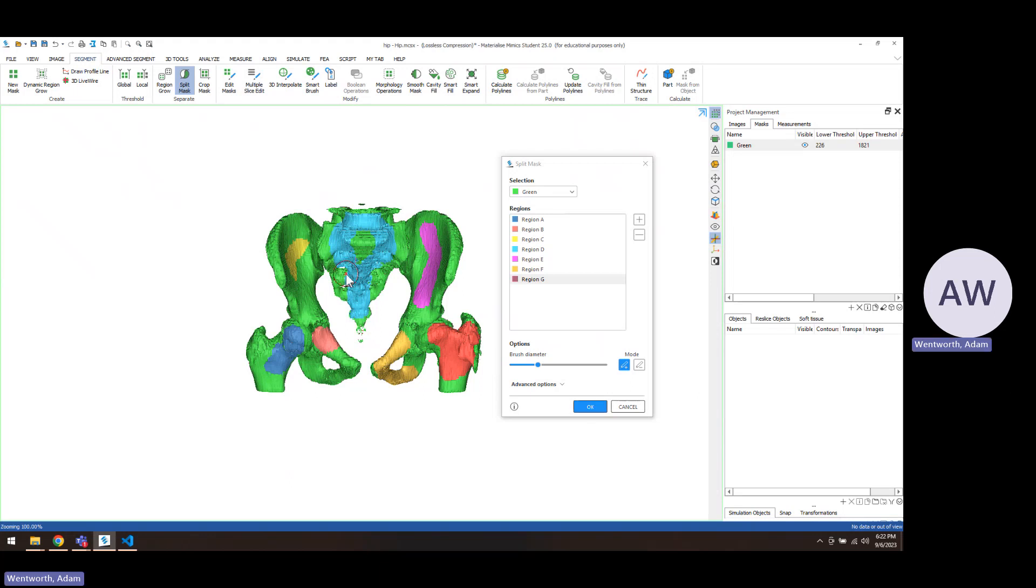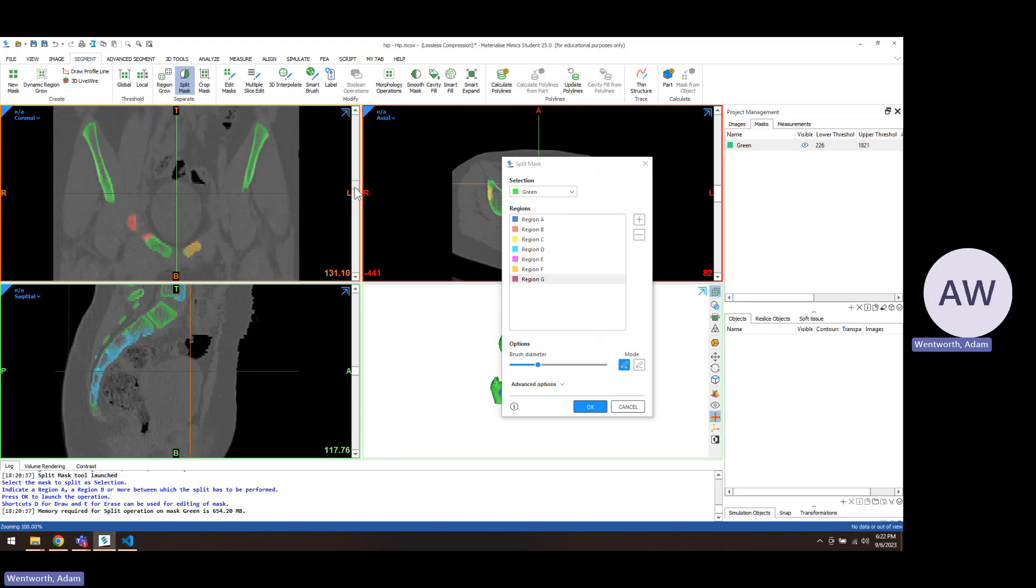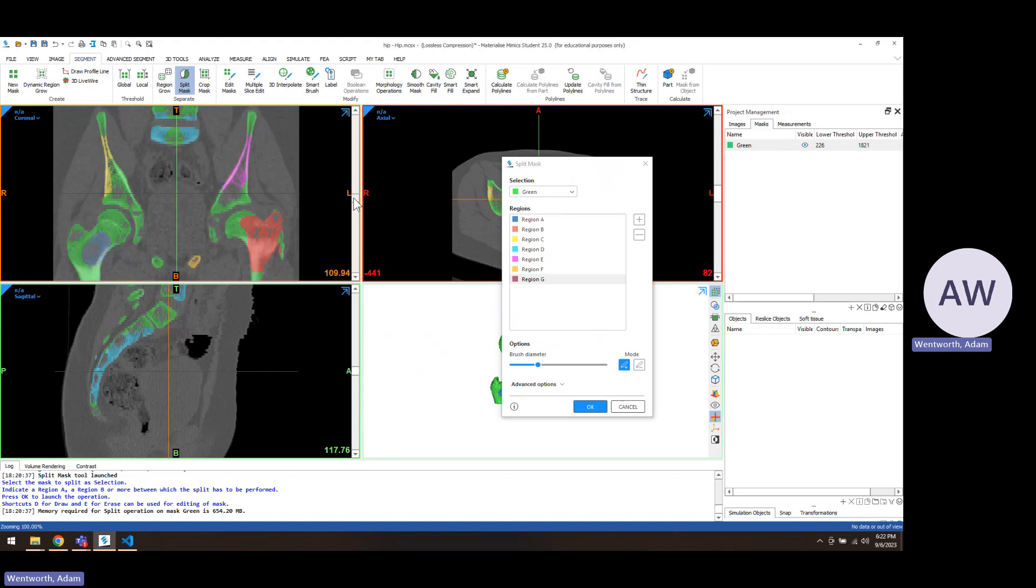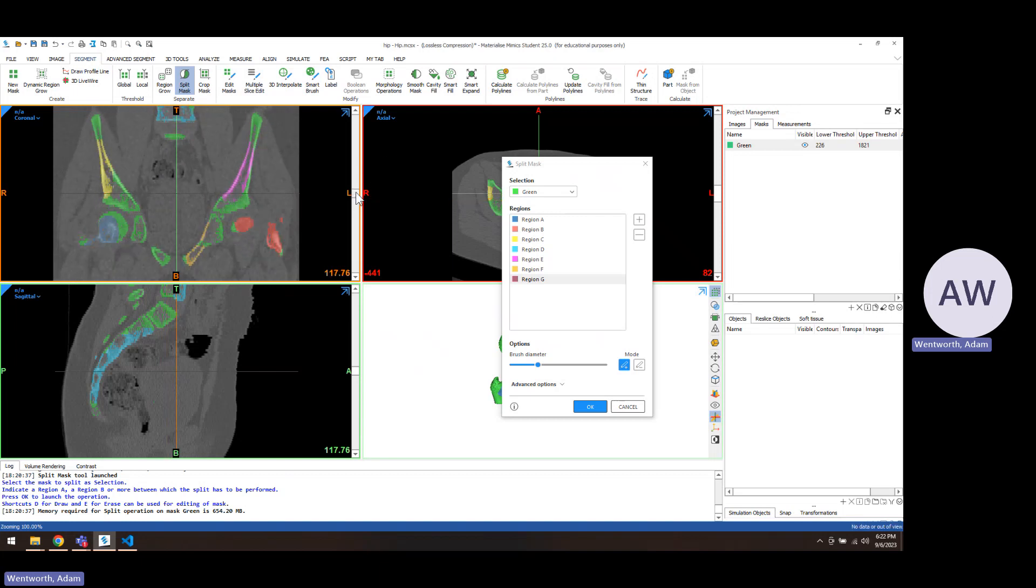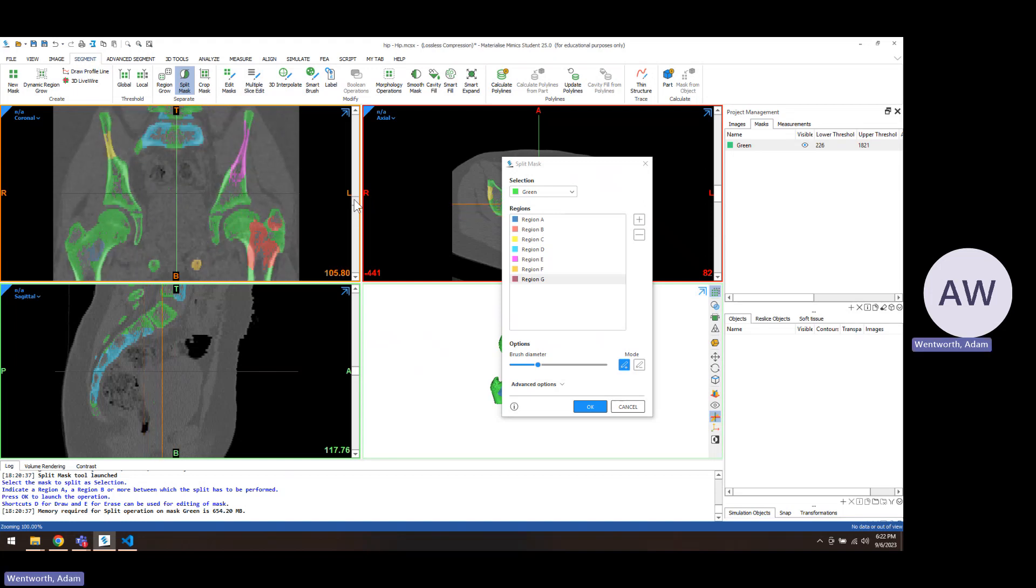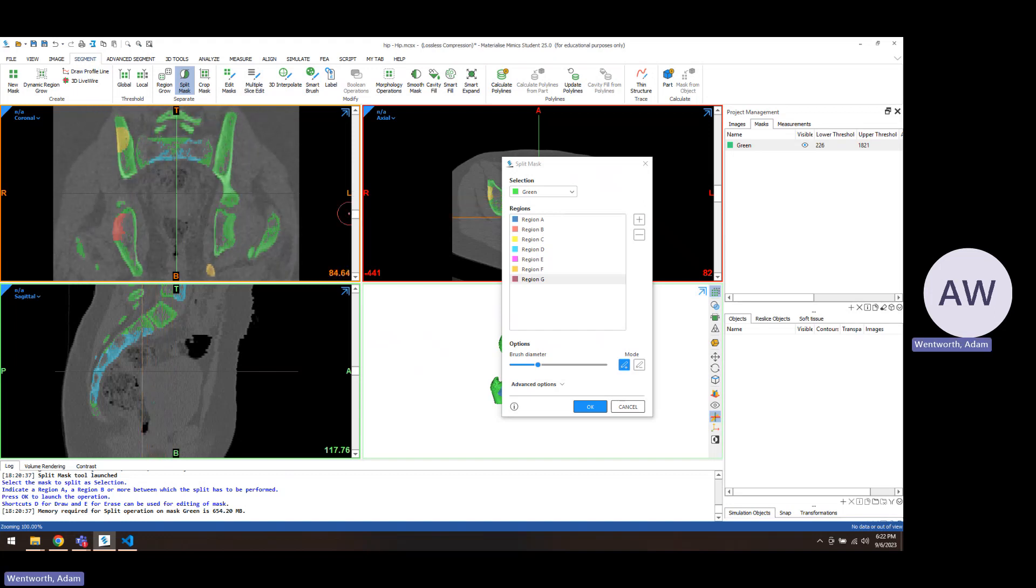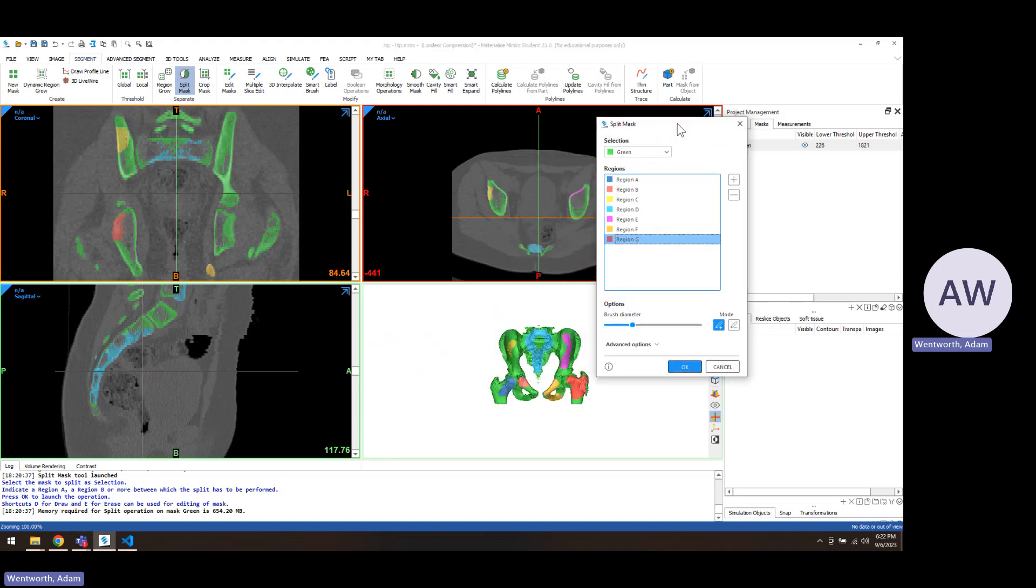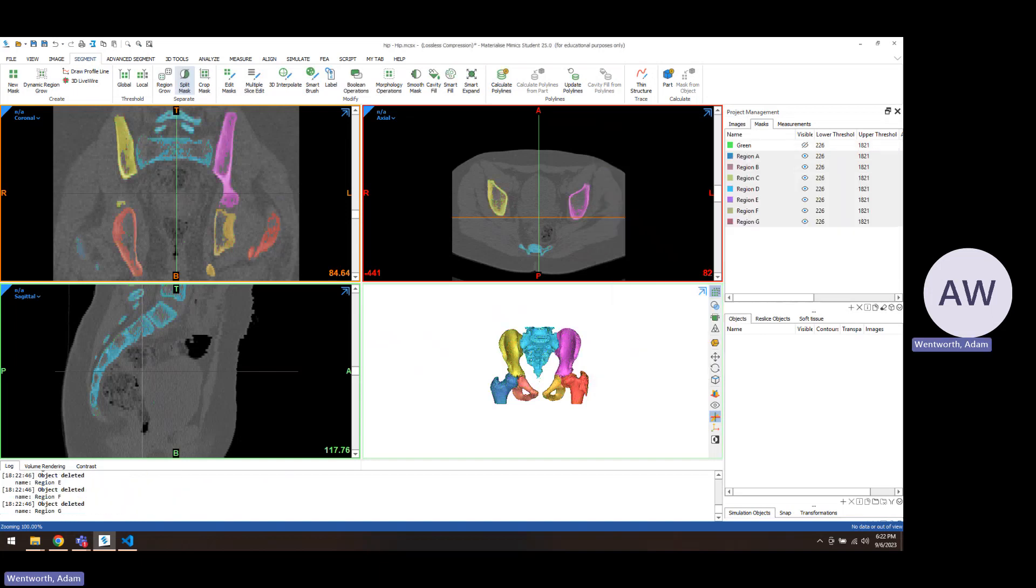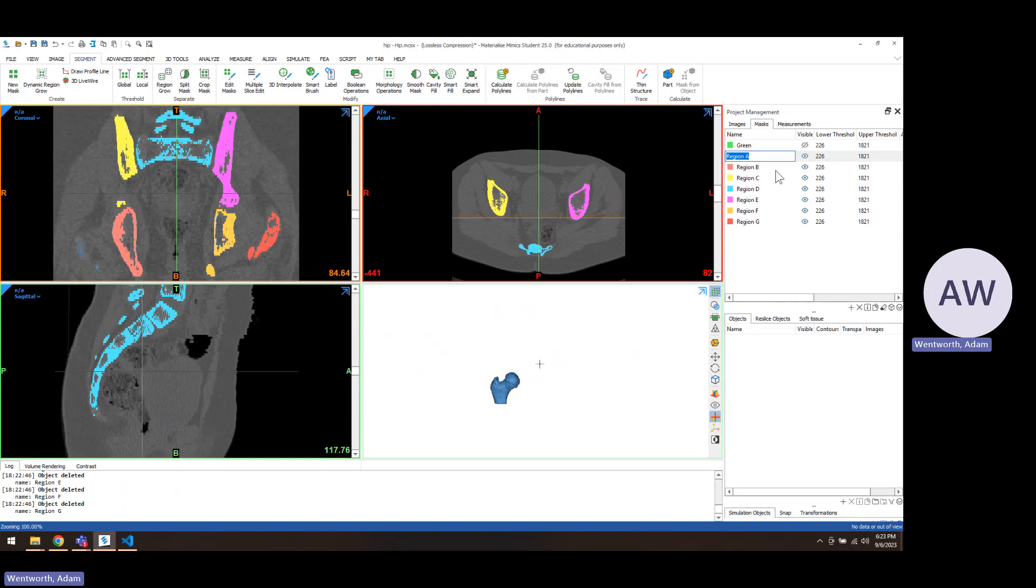And you have to take more time if the pieces are more connected. So if you hit spacebar while it's in the full screen, you'll see if there's any of these areas that are really touching each other in the mask. Maybe like right here, that is pretty close, but they're not touching by a few pixels. So I don't think it's going to be much of an issue. And then there's the SI joint up here and those are not touching at all. So we're just going to hit OK. And then you can watch it on that 3D down there, how well it works. This is one of the nicest functions, I think, and it makes to be able to separate all these things very quickly.